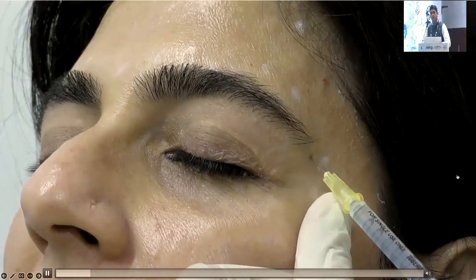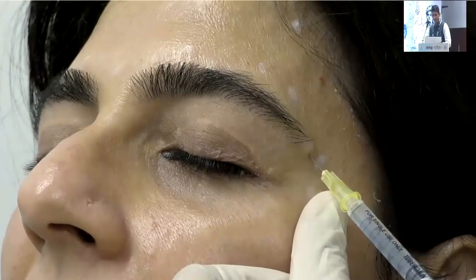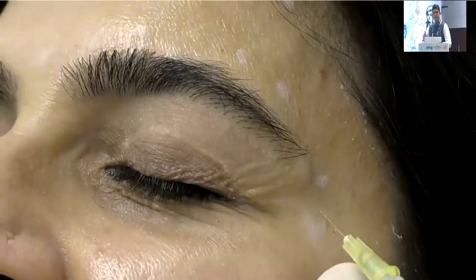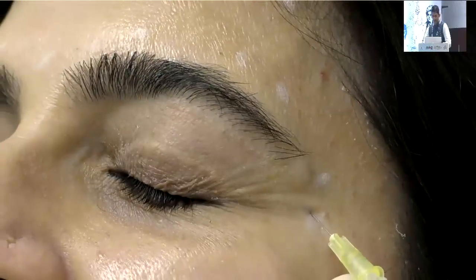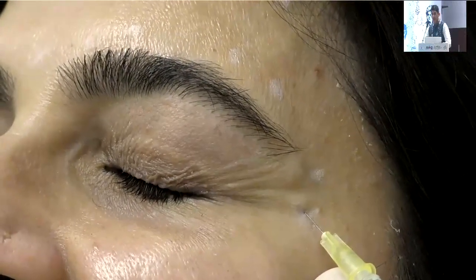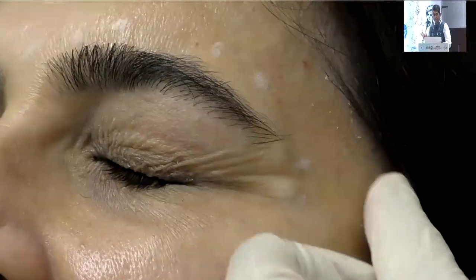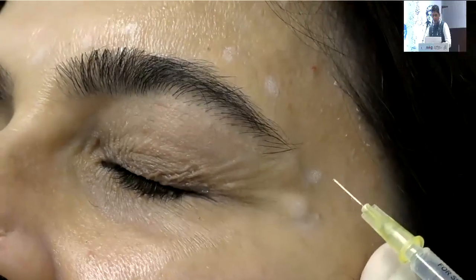So I use a 30 gauge needle. 29 gauge is good enough. Now 31 gauge is also available. And a 1 cc syringe because the resistance is less and easy to calibrate. Once you're experienced, you can inject with the needle pointing towards the eyeball or the orbital rim. Otherwise, you can go in a different direction away from the eyeball if you're not confident.